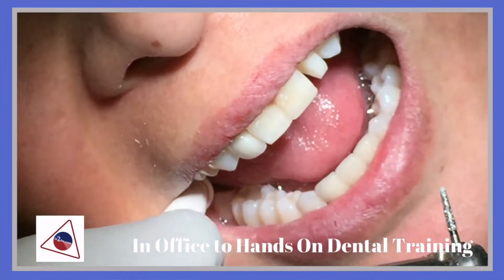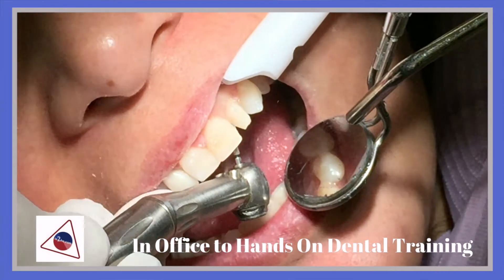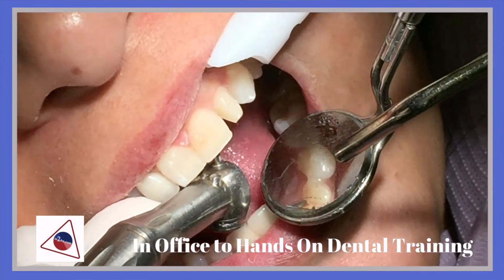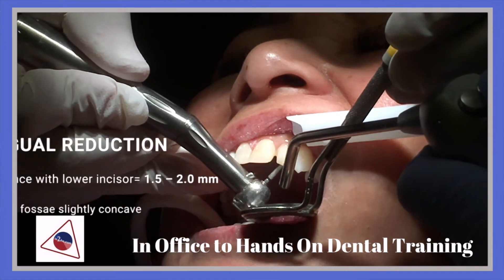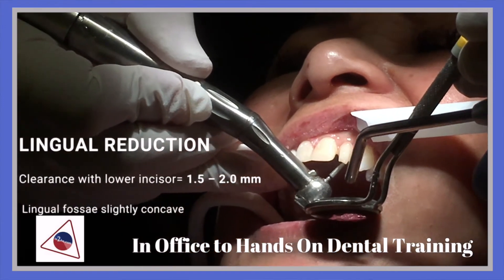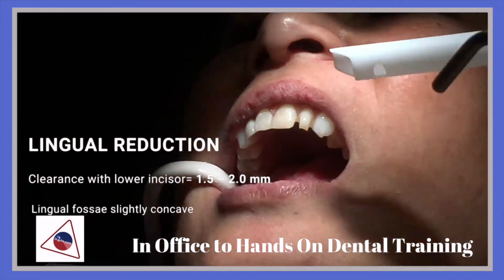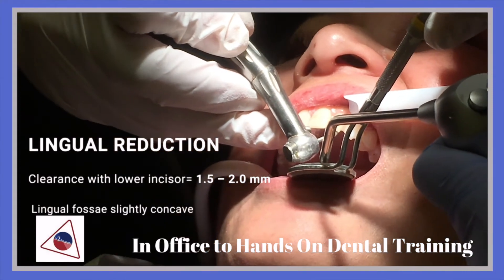There is still some reduction needed on the mesial lingual surface of tooth number 10. The lingual reduction — important to note that it has to at least reduce the margin of tooth number 10. You should have at least 1.5mm to 2mm of clearance. And the lingual fossa is slightly concave.